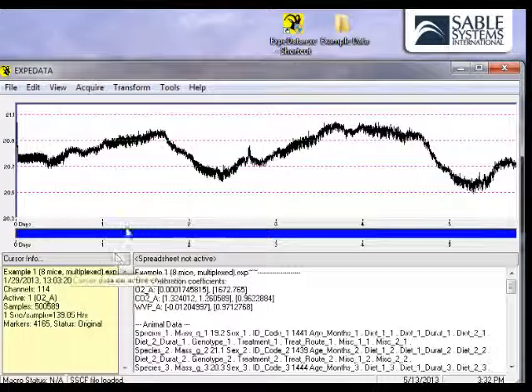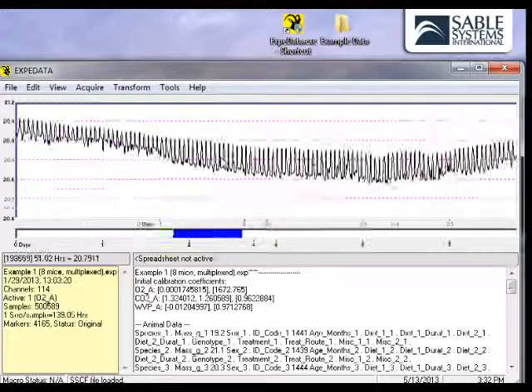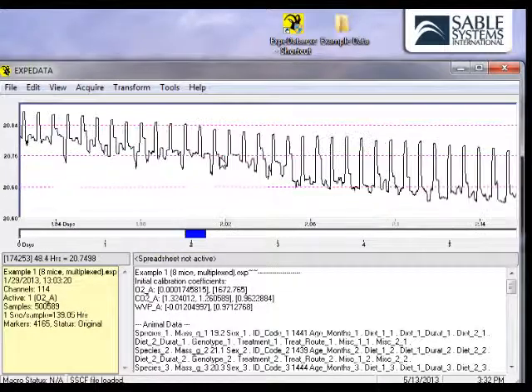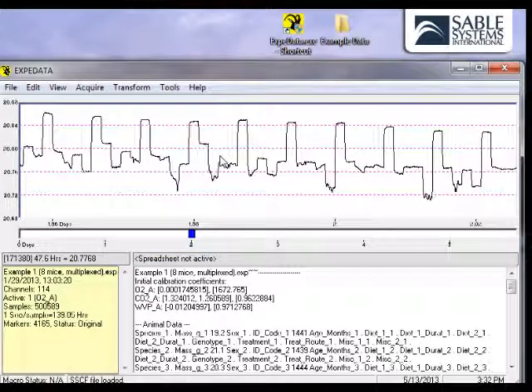We can look at any screen in much more detail. To do so, simply use the scroll wheel, and you can zoom in and examine a recording in as much detail as you wish.